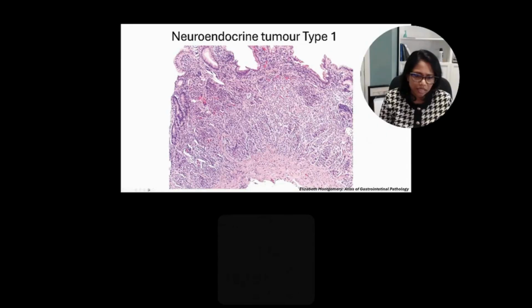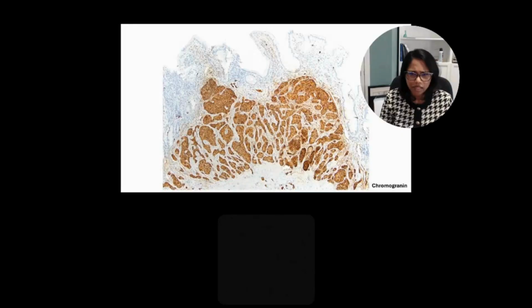And you can see that the biopsy is filled with a proliferation of nests and trabecular nests of small cells with, you can imagine, stippled chromatin in keeping with a neuroendocrine tumor, but I'd absolutely do the markers here, and a Ki-67 or proliferation index of sorts. And here you have chromogranin highlighting this neuroendocrine tumor.